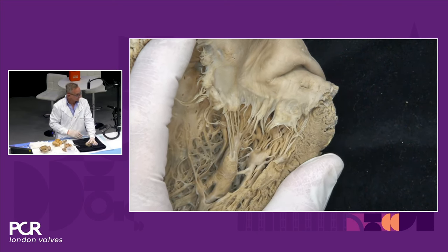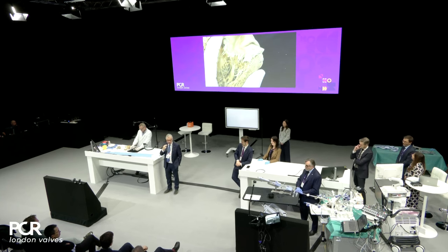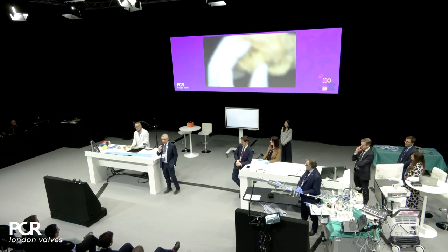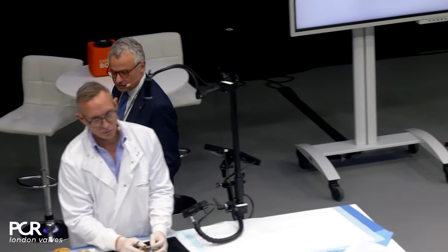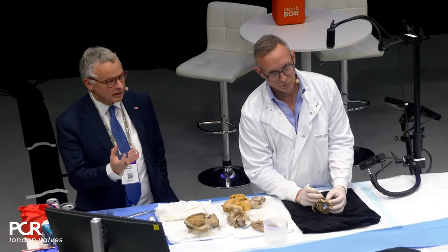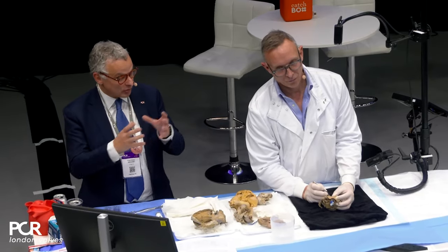But, so you know, guys, you look at this picture and remember this picture in your career. Never try to grasp leaflets where the jet comes from in functional MR. You know, the largest jet happens to be in these folds because there is less tissue. The height of the leaflet is the shortest at the level of the clefts. Here is where you have the most concentrated PISA. You know, the most flow goes from there.